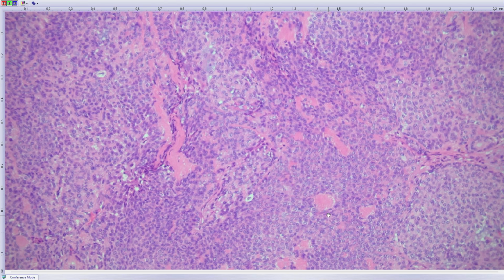So collagenous crystalloids and collagenous spherules are the finding typically seen in myoepithelial tumors, cellular pleomorphic adenoma or benign myoepithelioma. Around these structures you can see cells which are called hyaline or plasmacytoid cells, which are modified myoepithelial cells. So finally, the diagnosis is benign, and that's a big difference from adenoid cystic carcinoma.